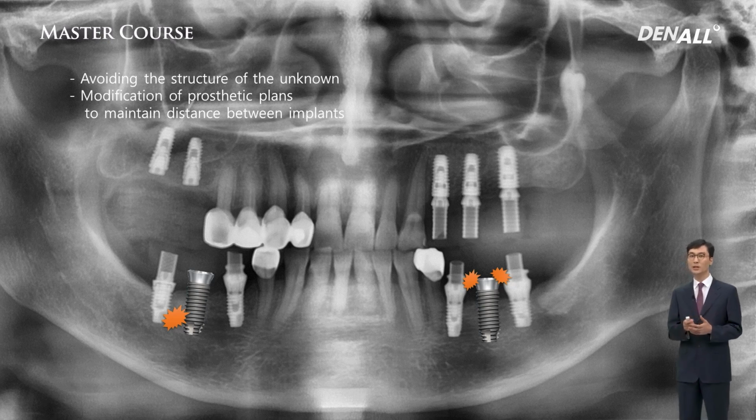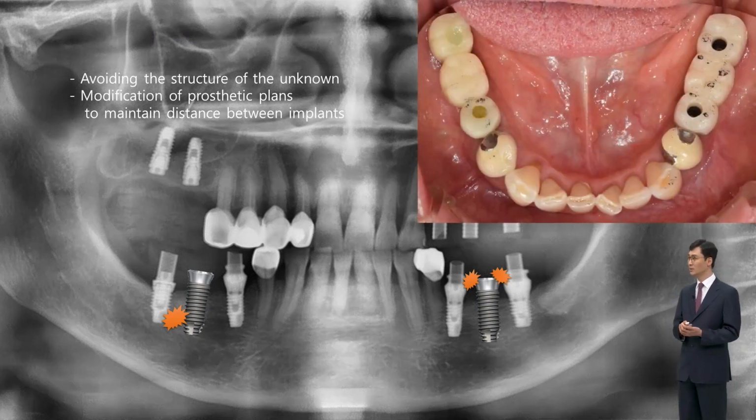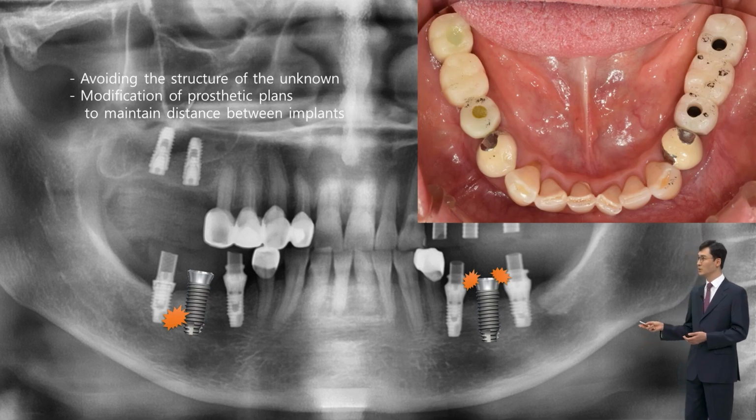In the case of number 46, I wanted to avoid the lesion, so I placed the implants mesially and distally. Implant provisional have been provided. In the end, the patient received the implant, fixed partial denture.